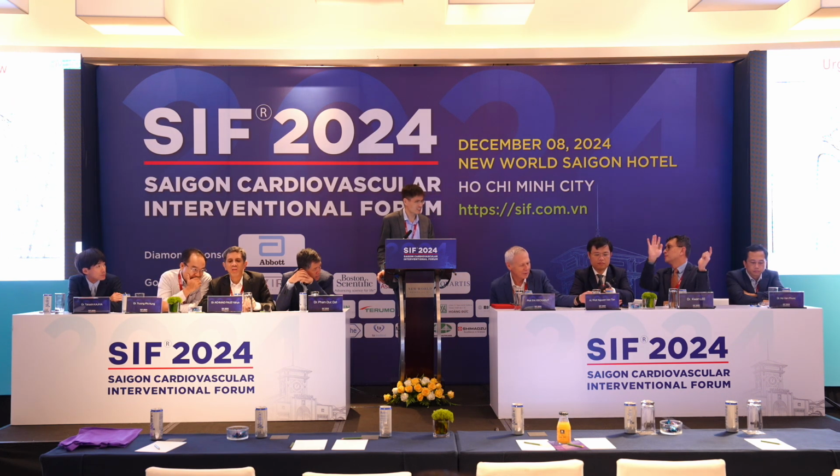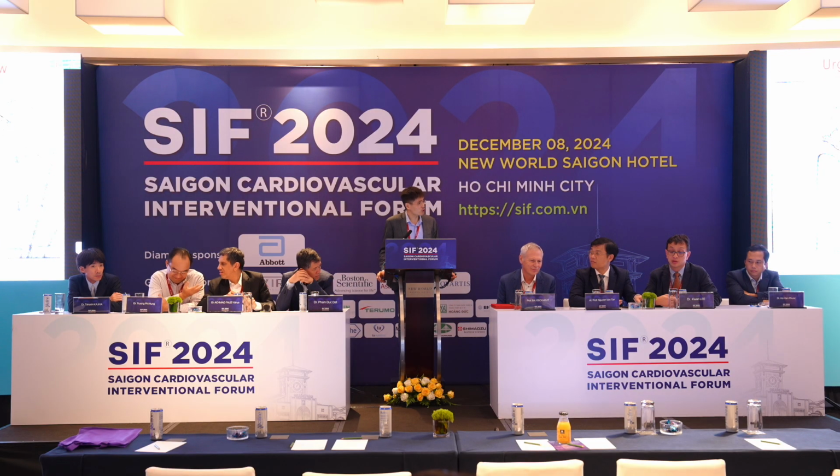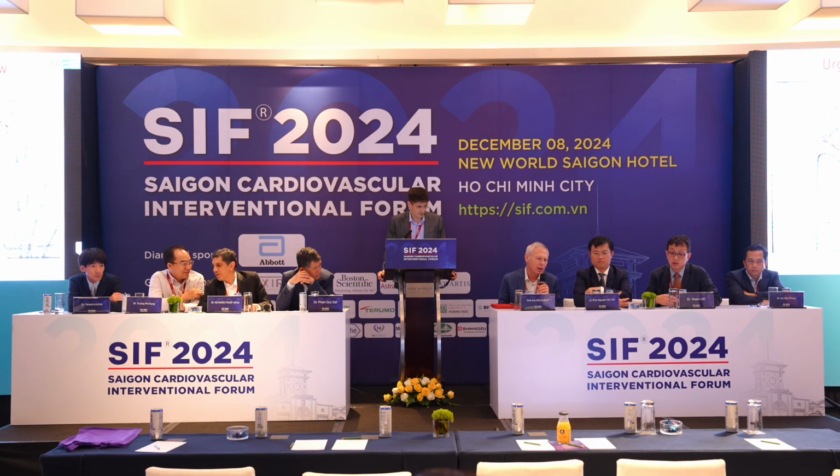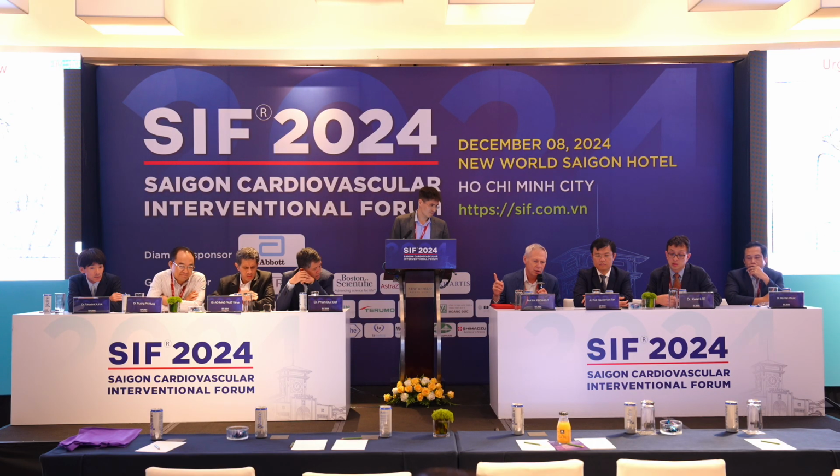Definitely, it's not a surgical candidate, but if you want to do it transcatheter, what kind of device can you use, Eric? Can you give me some advice on that? So we did a few. The last one I did a few weeks ago was as a complication of a failed transeptal puncture. The patient had a fistula between the non-coronary sinus and the right atrium.